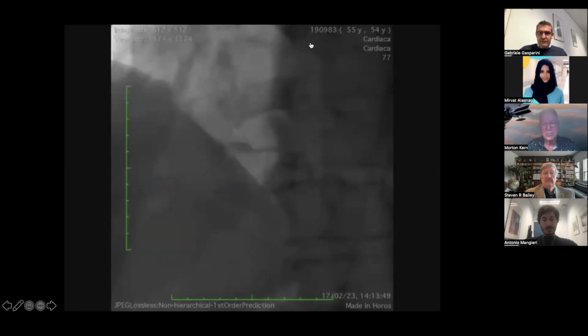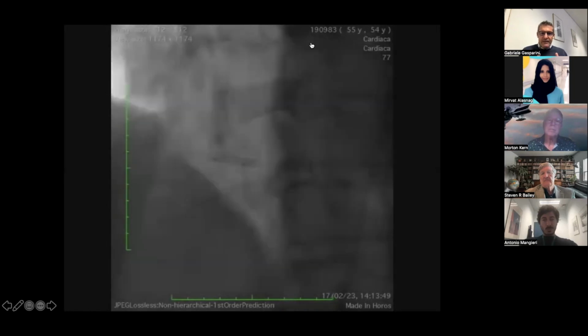The concentrated force is mainly due to the fact that when you apply just a vertical force on the blade, the pressure you can exert is really high in terms of creating a cut or cracks. This is the mechanism why we use cutting balloons to crack calcium, generally going up to high atmospheres. But in this case, we don't have to cut a hard tissue.